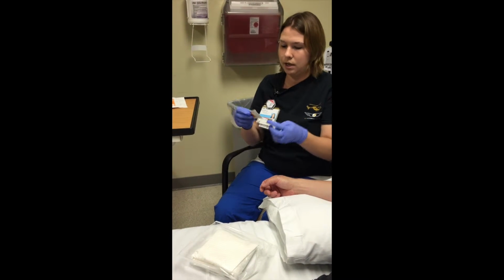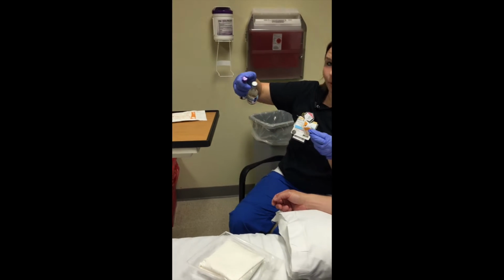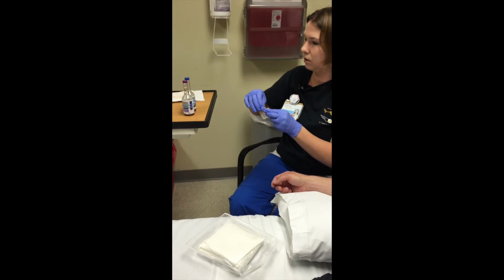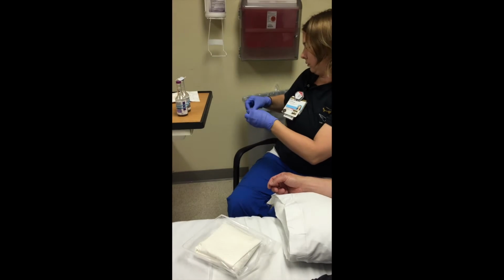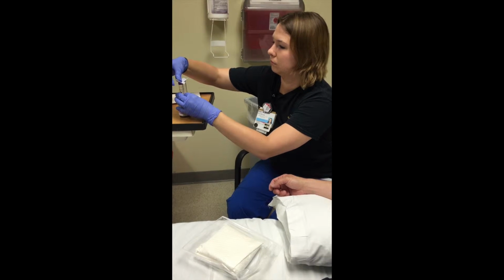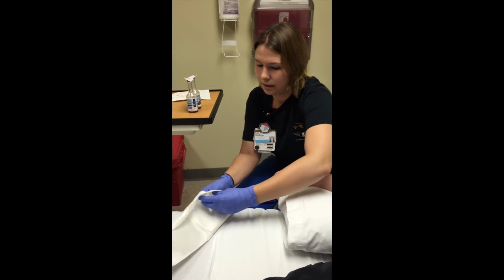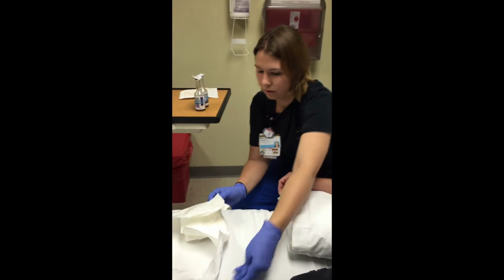You're then going to take your alcohol prep pads and pop off the caps that are on the top of the bottles. You're going to clean the top of the bottles. You're going to open up the kit. The inside of this is sterile, so you want to make sure that you're not touching the inside with your regular gloves.